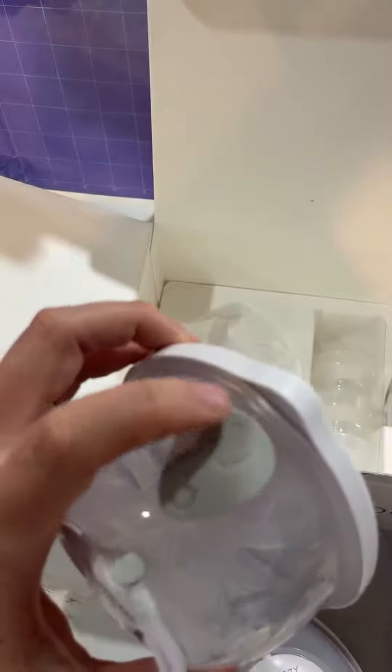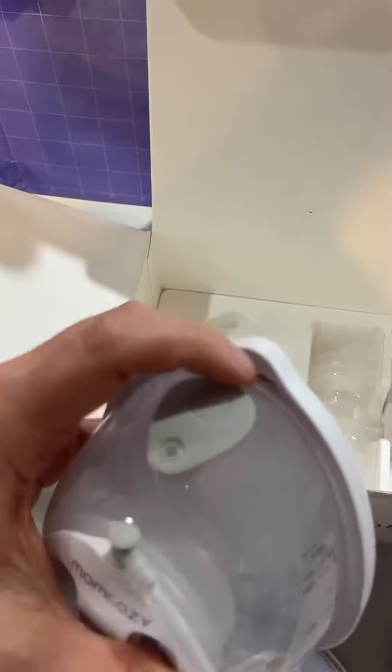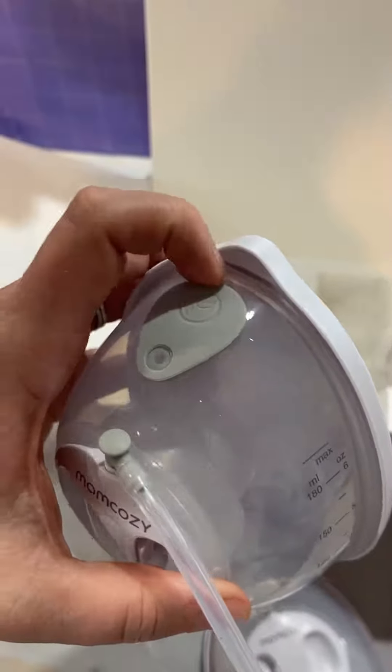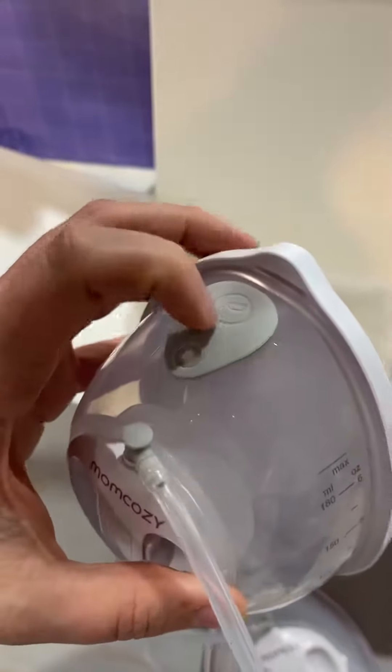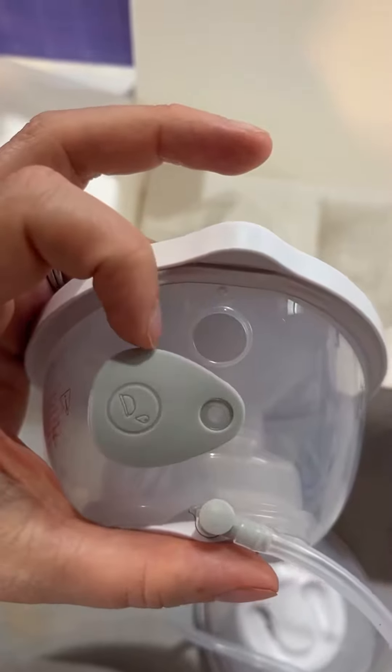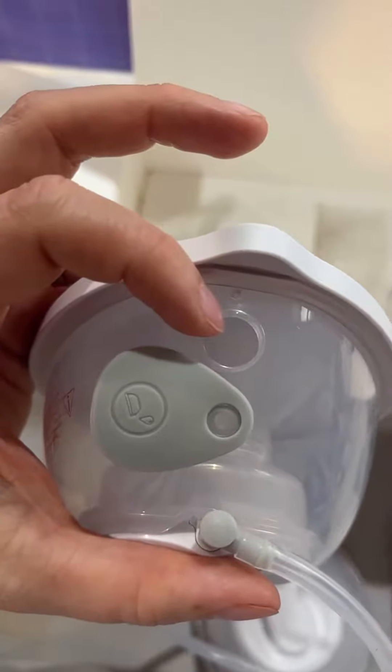One really cool feature is in order to actually empty the milk — instead of taking all of these silicone and plastic parts apart to actually get the milk out, there is a dropper here. It opens up like so, and you can actually empty the milk through this hole.